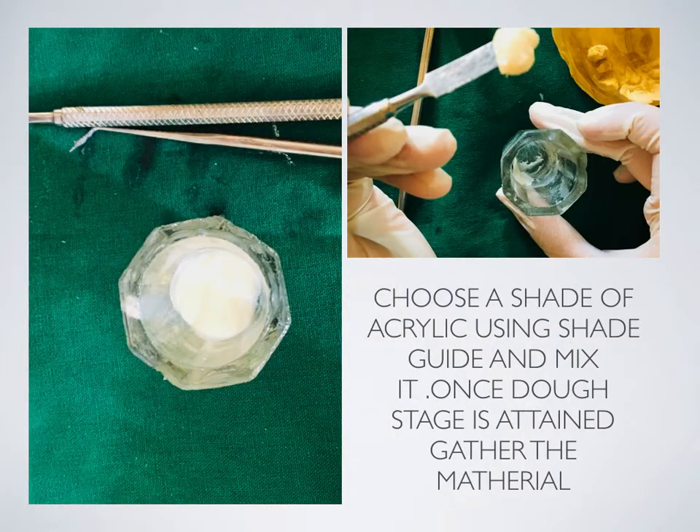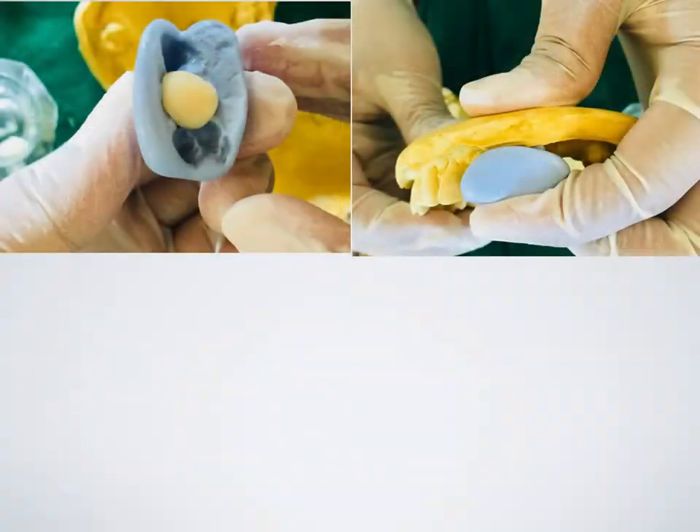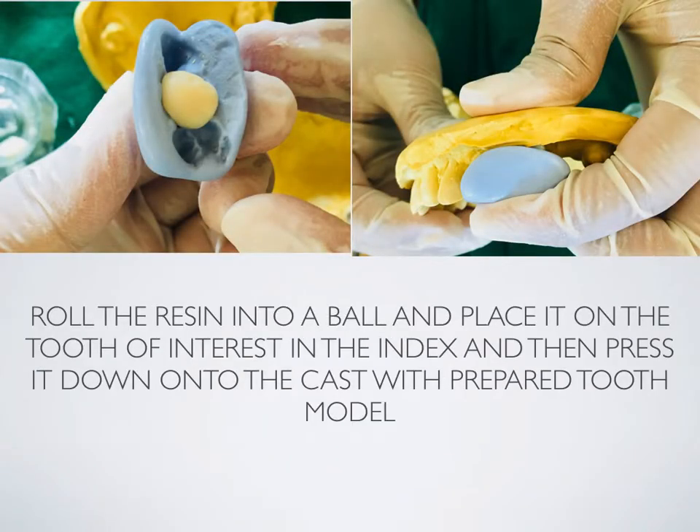Choose a shade of acrylic using a shade guide and mix it. Once the dough stage is attained, gather the material. Roll the resin into a ball and place it on the tooth of interest in the index, then press it down onto the cast with the prepared tooth.